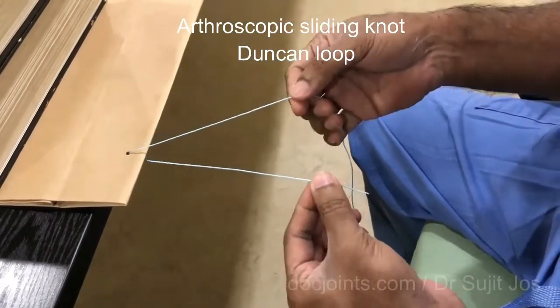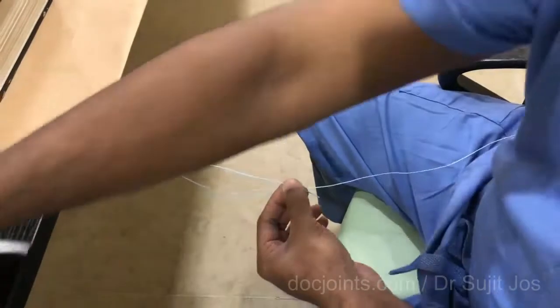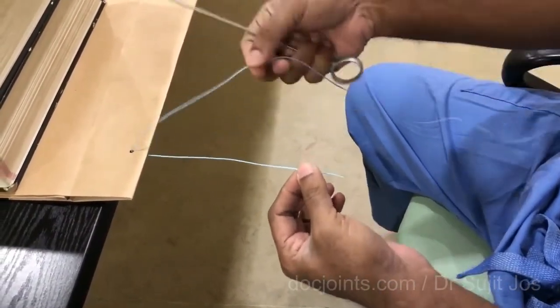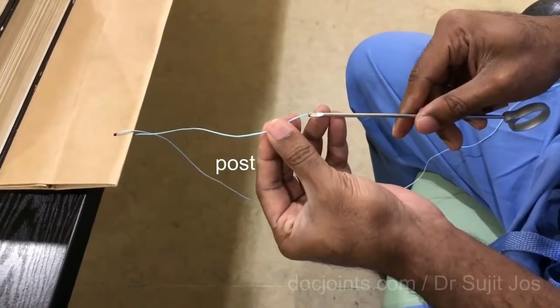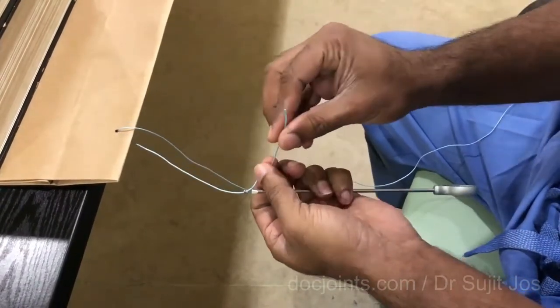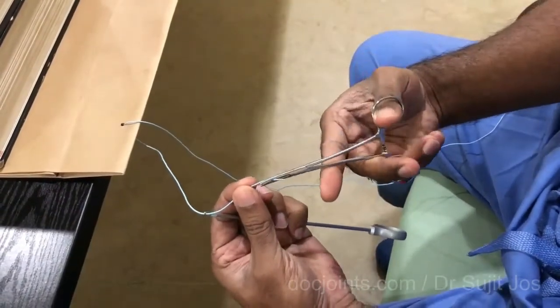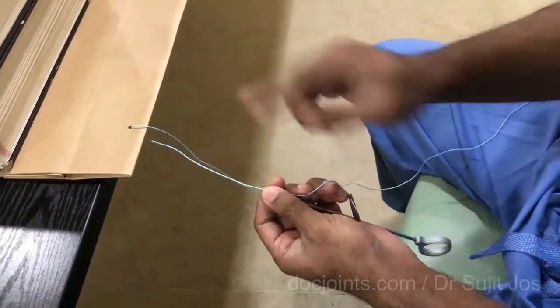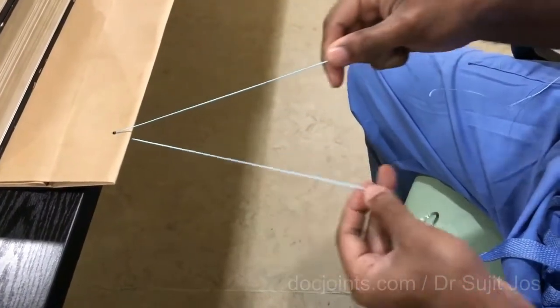Arthroscopic knot tying. We will have two limbs of threads. We have to decide one as a post and the other one as a non-post. The post has to be shorter. Pass the knot pusher into the post and mark it with a mosquito. This step is very important — mark it — because you can get confused between the post and the non-post. If you forget which one is the post, it could have a problem of sliding later.